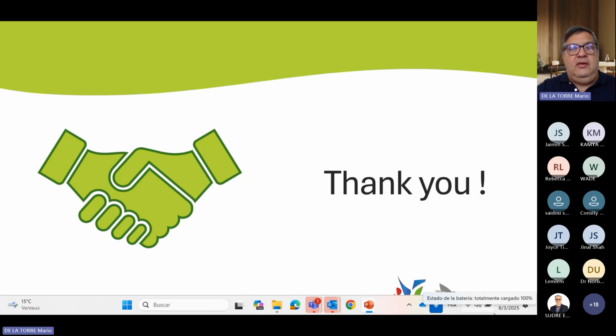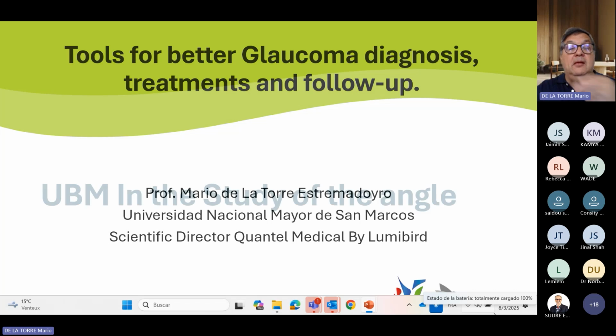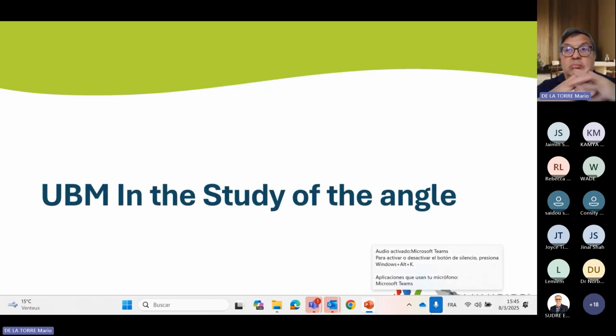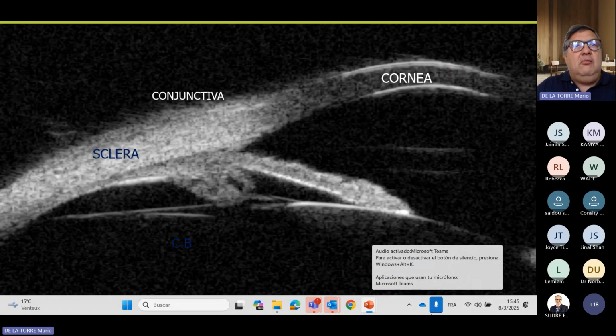Only a few things about the tools that we can have in your area for glaucoma diagnosis, treatment and follow-up. I'd like to talk for a few minutes about the UBM and the study of the angle. The people say, oh, you are talking about UBM, but we use gonioscopy. This is the gold standard. Yes, we have the gold standard, but we can't see what's happening behind the iris.